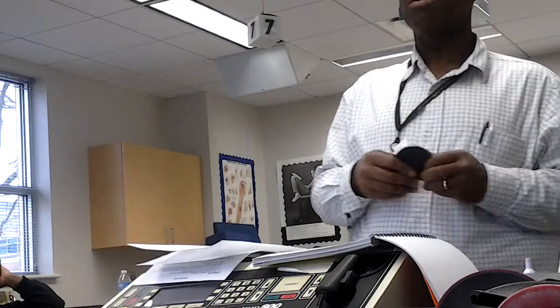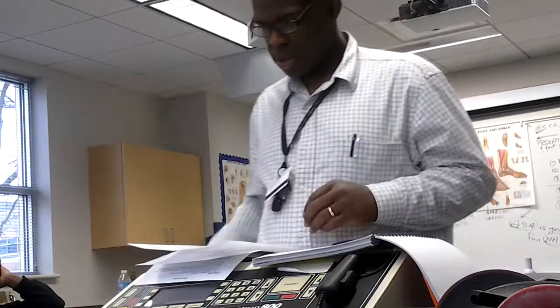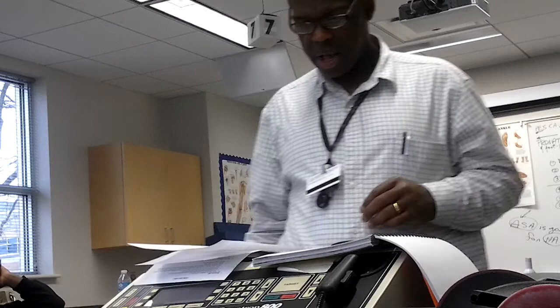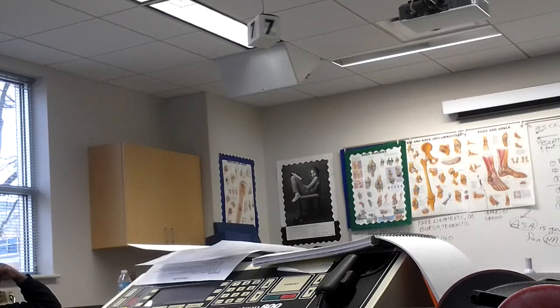So you don't want the person to say, "Oh, that hurts." So if you have pads that can handle all of that energy, you won't have all of that going out. Same size pads with same intensity. I gave you a handout on interferential, and we talked about pad sizes. All right, so.